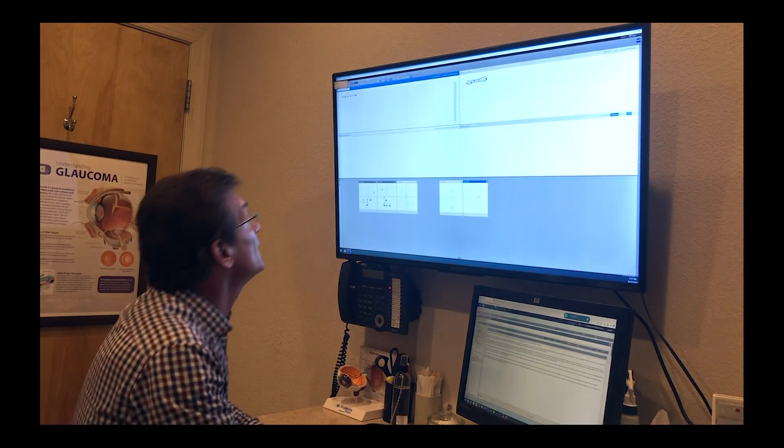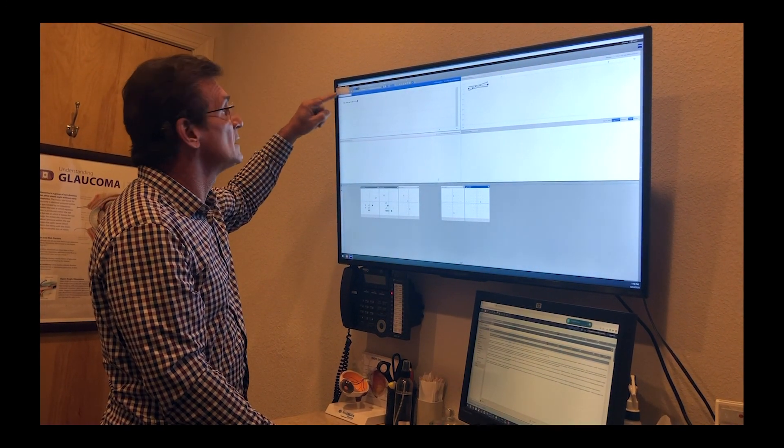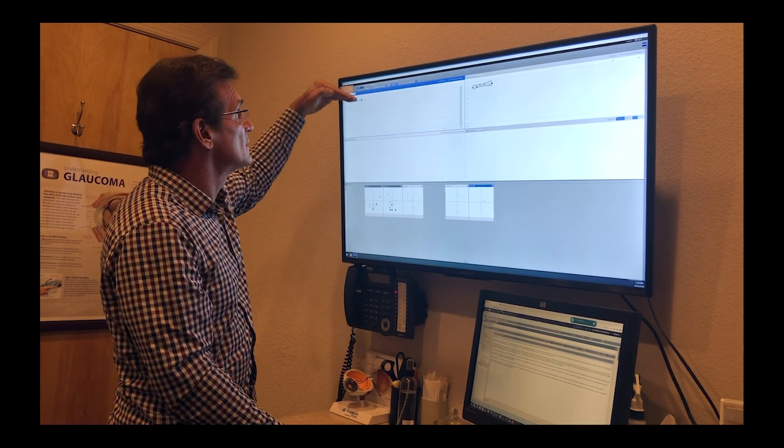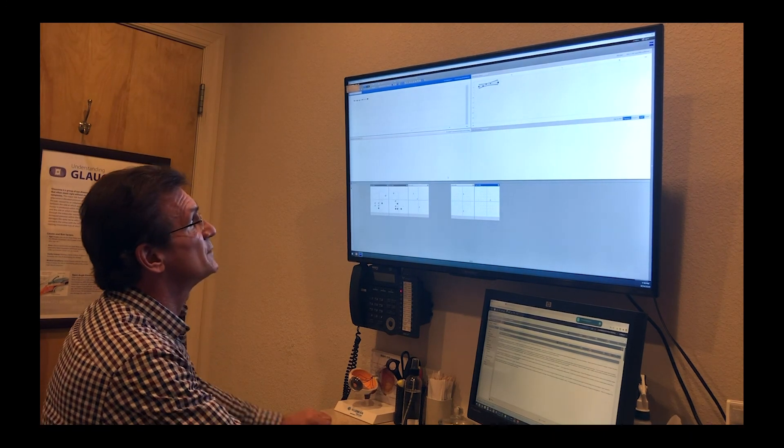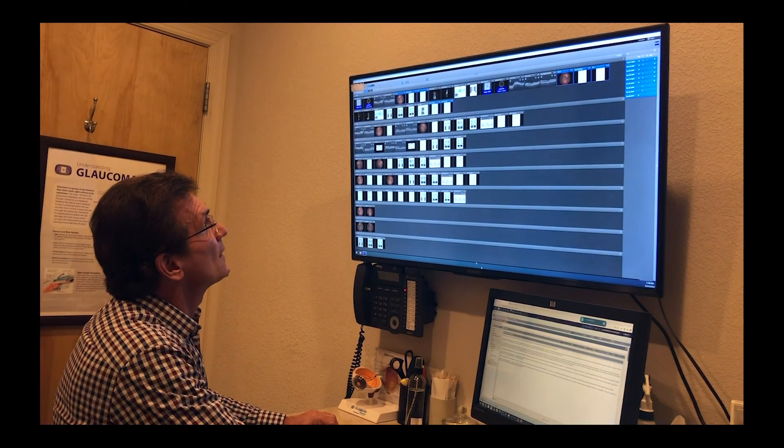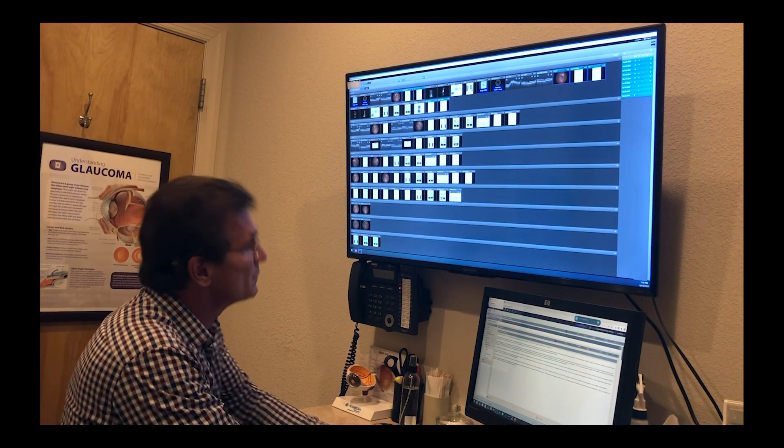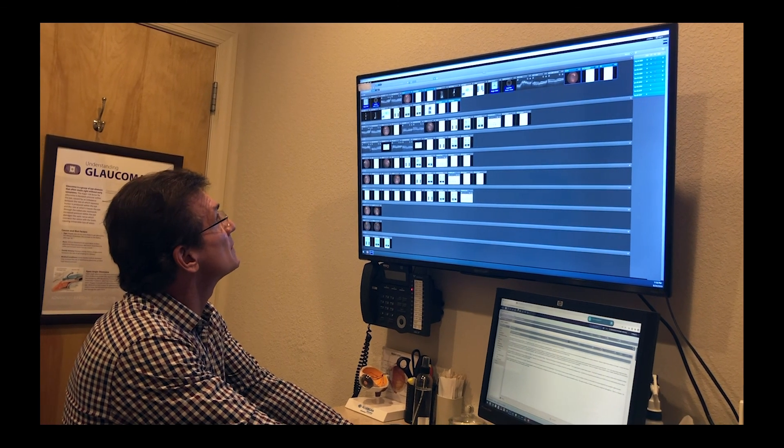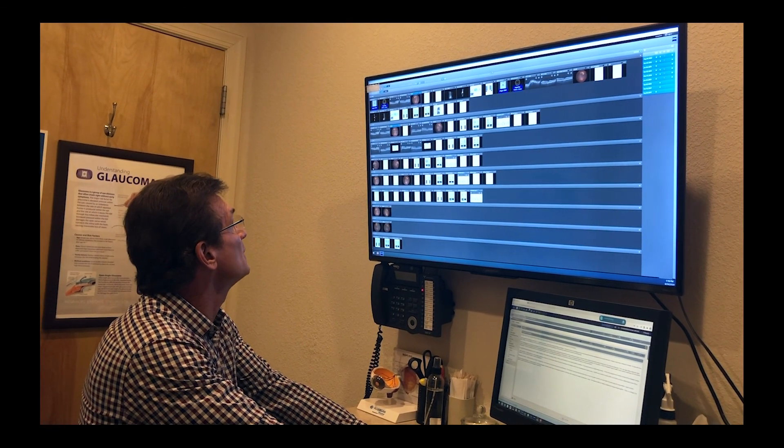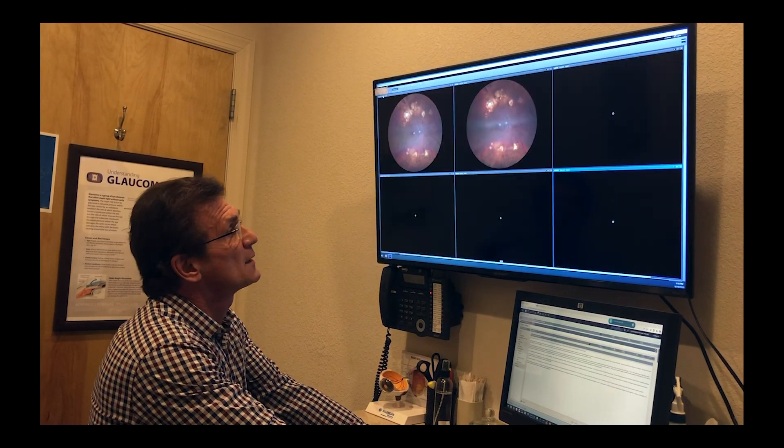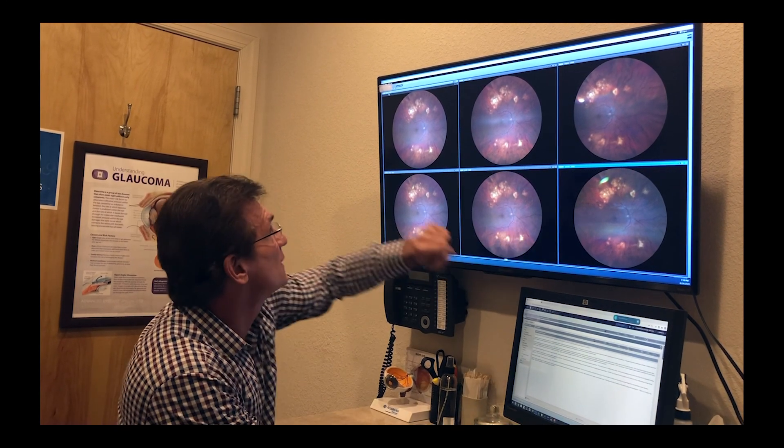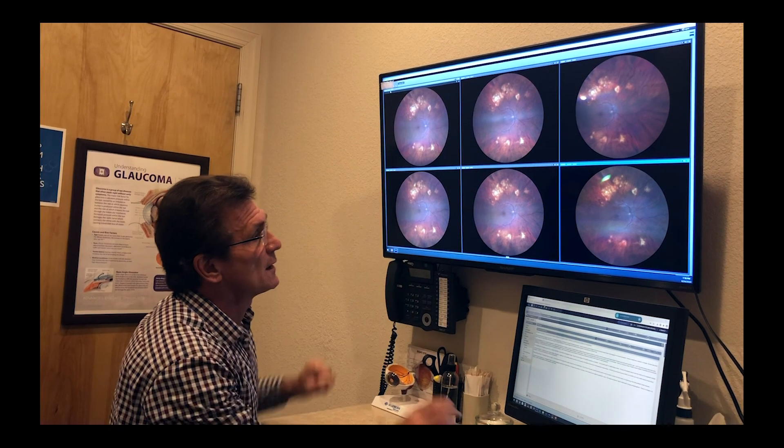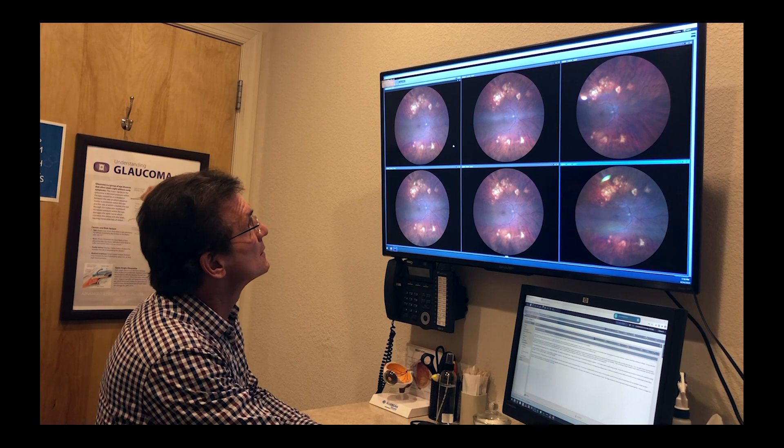Real nice is our structure function guided progression analysis. And here I can explain to the patient that here's his last examinations from 2017. As you can see, he's going in a linear fashion and there's no progression of some concern, an indication of a stable condition and stable disease processes. So now I go back to the original screen. If there's something in particular I want to examine more closely, let's say it's the right eye. I want to take a look at the fundus photo images over the past five or six examinations. I can pull those up with a click of a mouse and you can see from 2017 to today's examination and you can make a comparative statement.